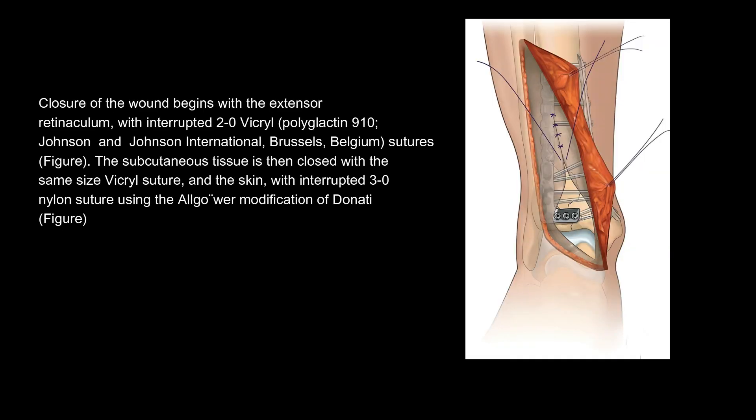Closure of the wound begins with the extensor retinaculum, with interrupted 2-0 Vicryl (polyglactin 910, Johnson & Johnson International, Brussels, Belgium) sutures. The subcutaneous tissue is then closed with the same size Vicryl suture, and the skin with interrupted 3-0 nylon suture using the Allgöwer-Donati (W modification of Donati) technique.